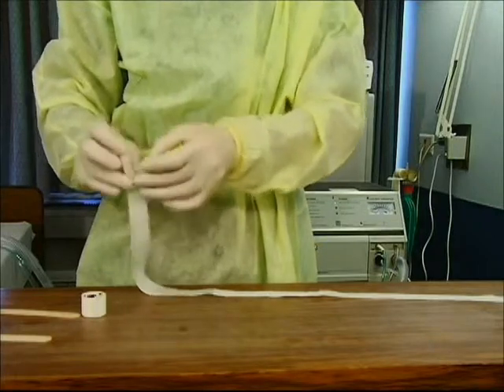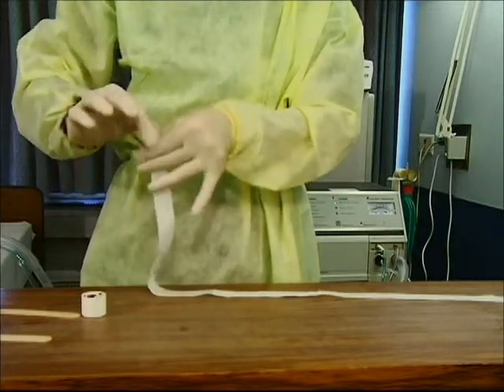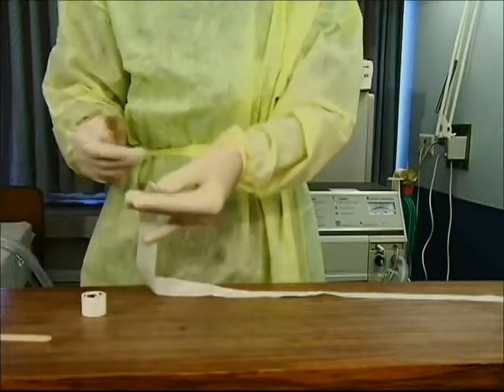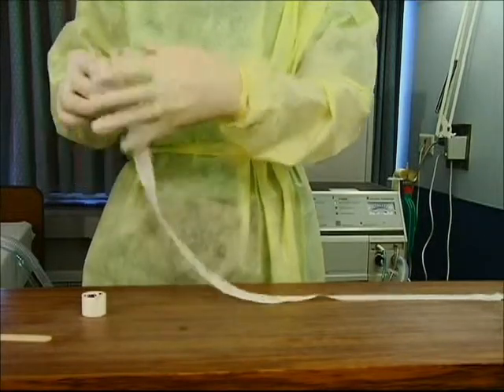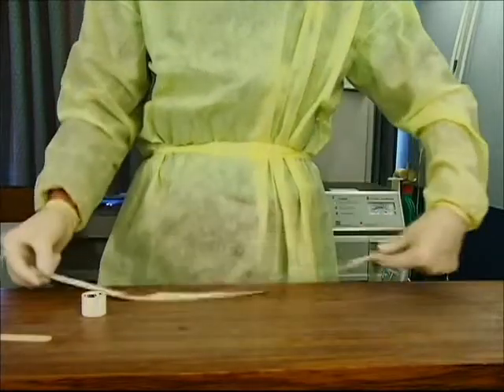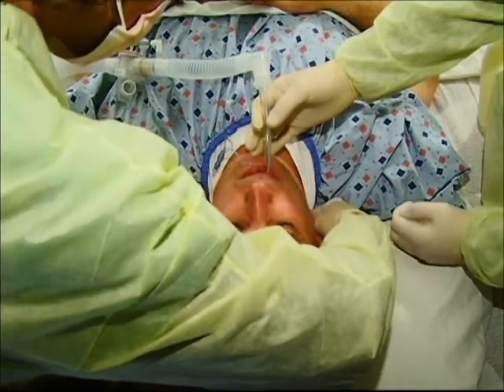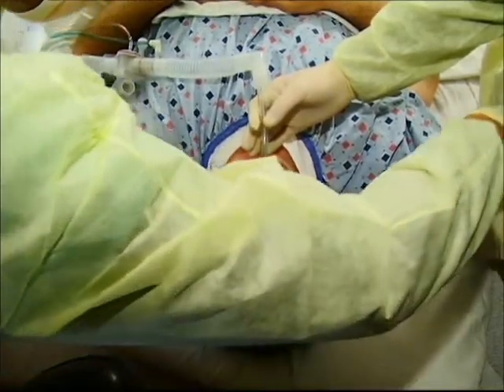Select one end of the tape and tear in half down the middle, approximately one inch in length. Fold ends down so the tape doesn't stick together. Next, fold tape in half over a tongue blade to the center where the four-inch piece of tape was placed, starting at the torn end. Folding the tape as previously demonstrated prevents tangling during the procedure. Slide the tongue blade behind the patient's neck and pull the tape up, removing the tongue blade.